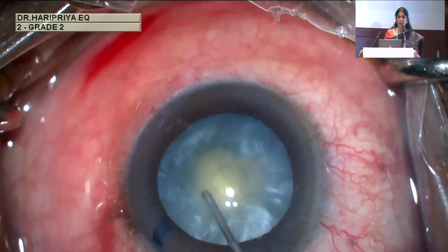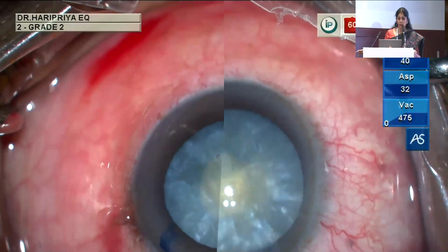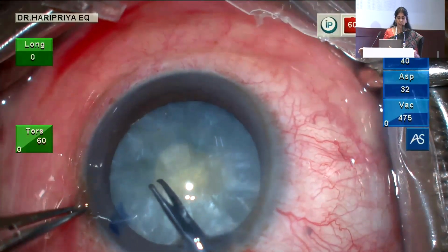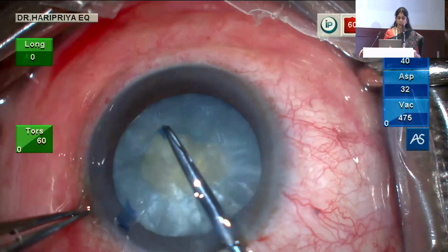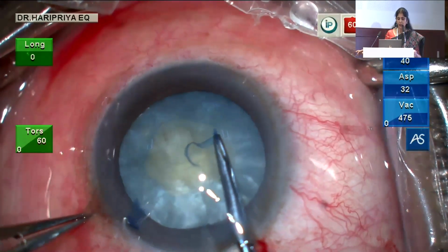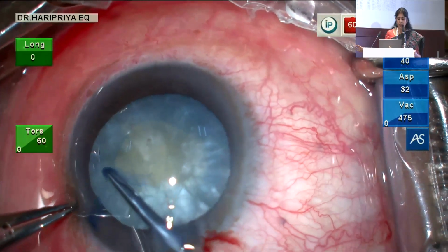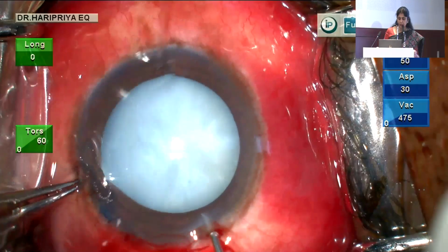Now because we have the capsule stain and there is contrast, one does not need to worry about the visibility. So after this, you can go ahead and make a double rhexis. Now your intralenticular pressure is reduced because the hydro is complete. And then you make a small nick with the vannas and then go ahead and enlarge your rhexis. And most of these capsules are friable, being an older age, so they don't tend to run away unless your intralenticular pressure is still high. So once that hydro is done, then this should be fine because you also have a good visibility and contrast.